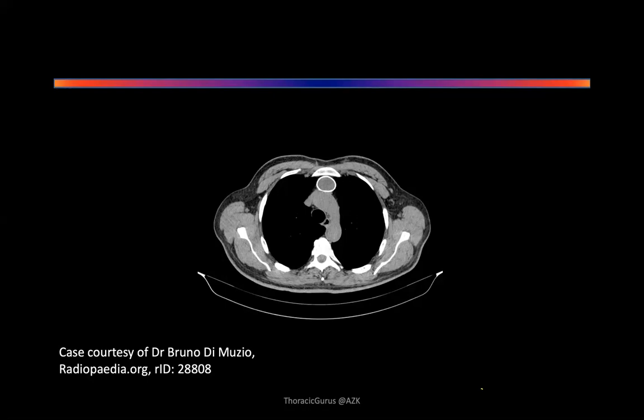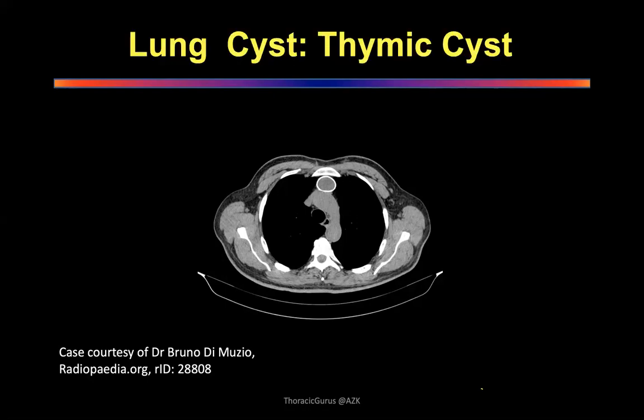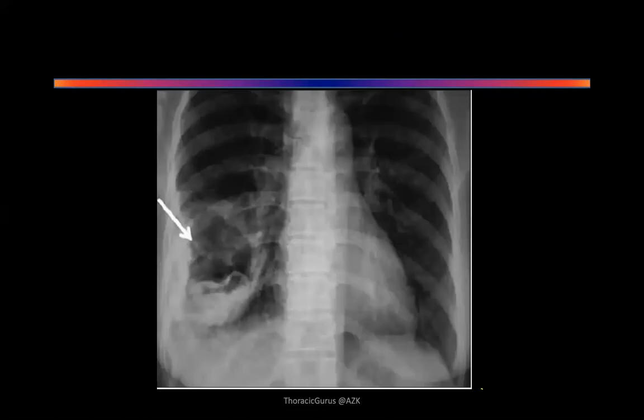What is it? Give me an answer. Probably a thymic cyst. I'm happy with that. That's simple. It could be a thymic cyst. It's quite obvious in that area. Okay, all right.